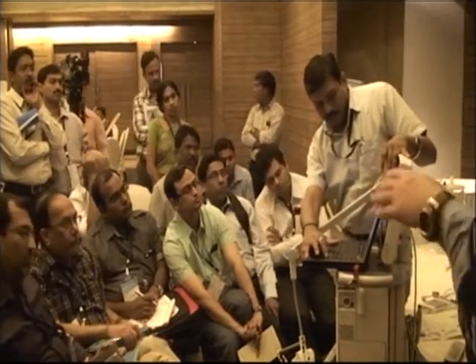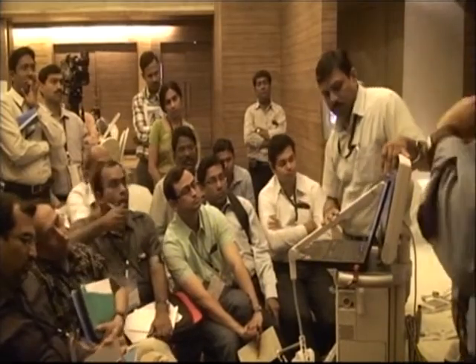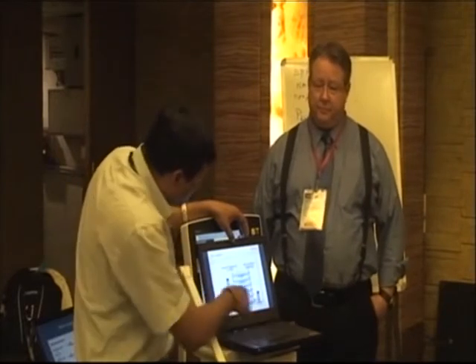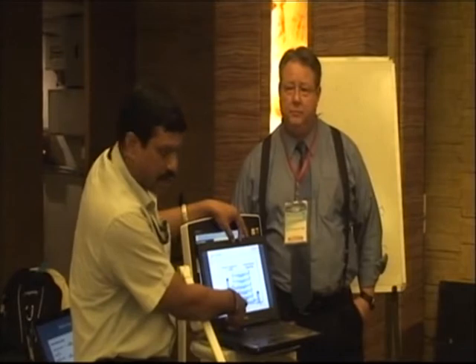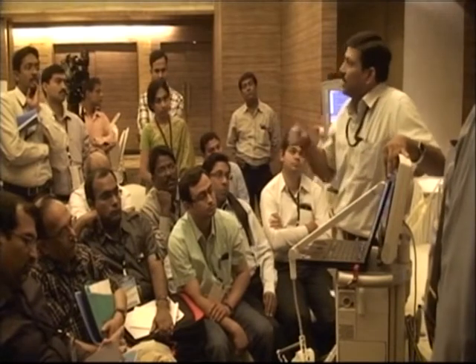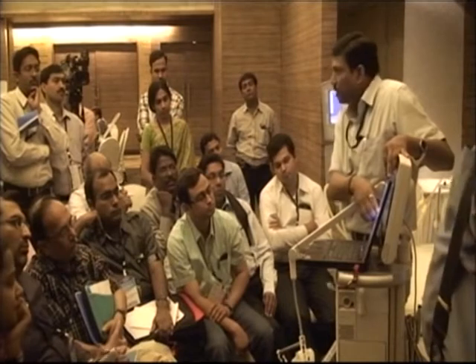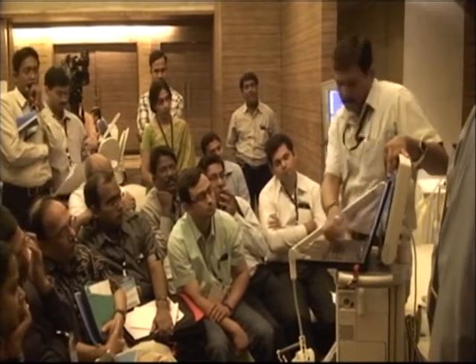So it adjusts based on how deep a breath they're taking. If they're taking real shallow breaths, they get relatively small breaths. If they take a big sigh, they get a bigger breath. Normally, when the patient triggers, a negative pressure is created, then the machine will give a breath. But in this, if the diaphragmatic activity is there, the excitement of the diaphragm, the machine gives a breath as soon as it gets the signal from the phrenic nerve, rather than wasting 100 milliseconds and then giving a breath.